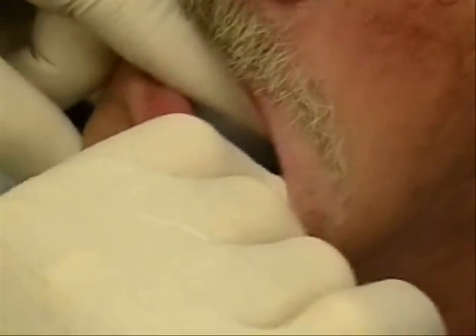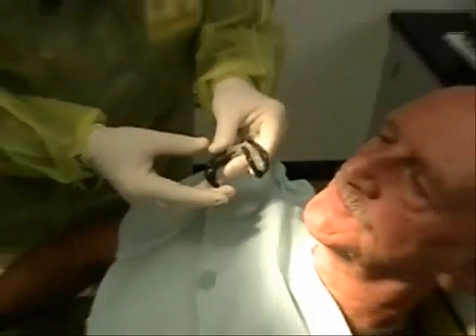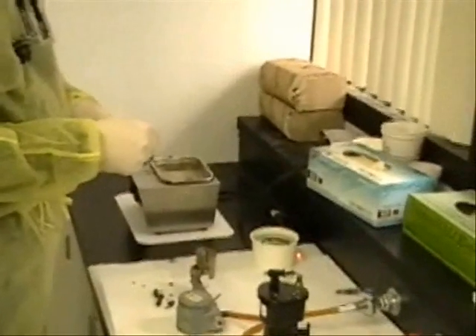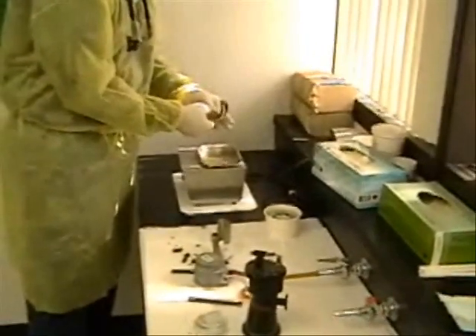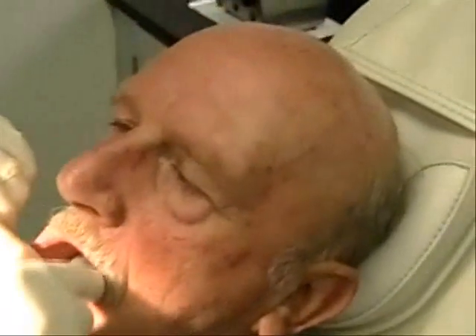You doing all right? If it bounces up on us, that's a sign that we're overextended. It's still staying down, so we're in good shape. I've got a little excess that I have to get off of it. I guess that lab goes better than I thought. That looks good. Wax temper just a little bit or it will burn you. I want you to stick your tongue out. Lick that upper lip for me. That's it. It still stays down — it's not bouncing on you.